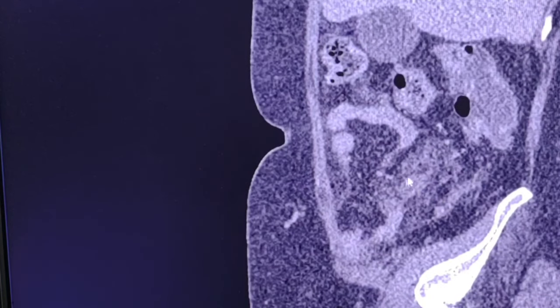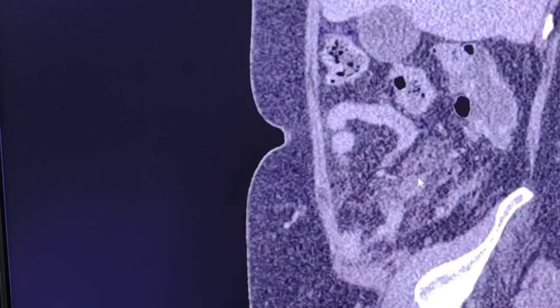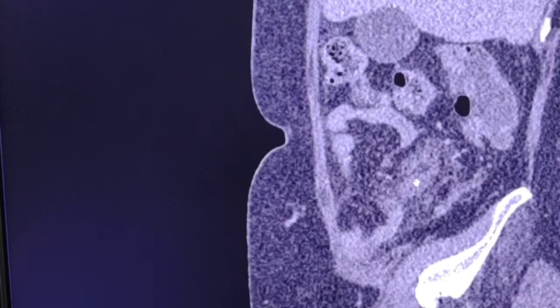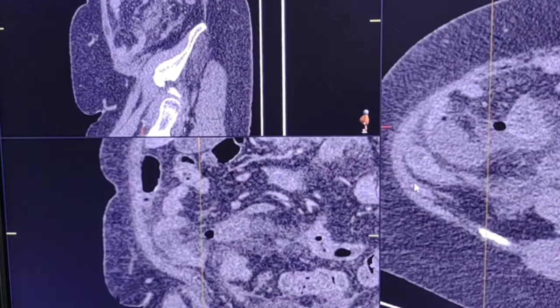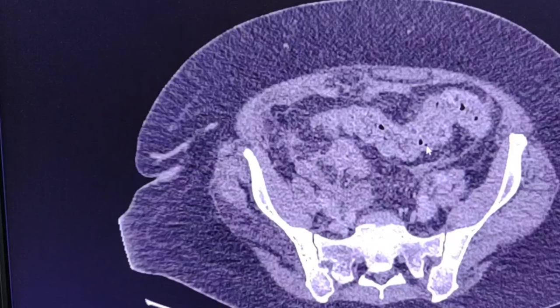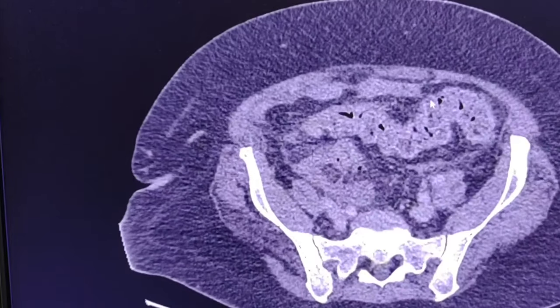The collection here is much more clear, surrounded by fat stranding. Another interesting finding is that there are some mural changes in multiple small and large bowel loops — reactive changes due to peritonitis. There is some wall thickening.